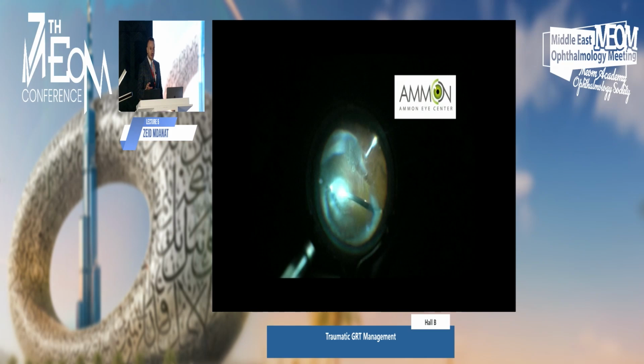So this is a middle-aged man who presented with a GRT and retinal fold detachment. We didn't know whether the fovea was on or off at the time. I'll show you during the video. This patient was actually amblyopic in this eye. He had cataract extraction and he was left aphakic. And this is one of the reasons I think why he presented with such a large GRT around 9 clock hours.